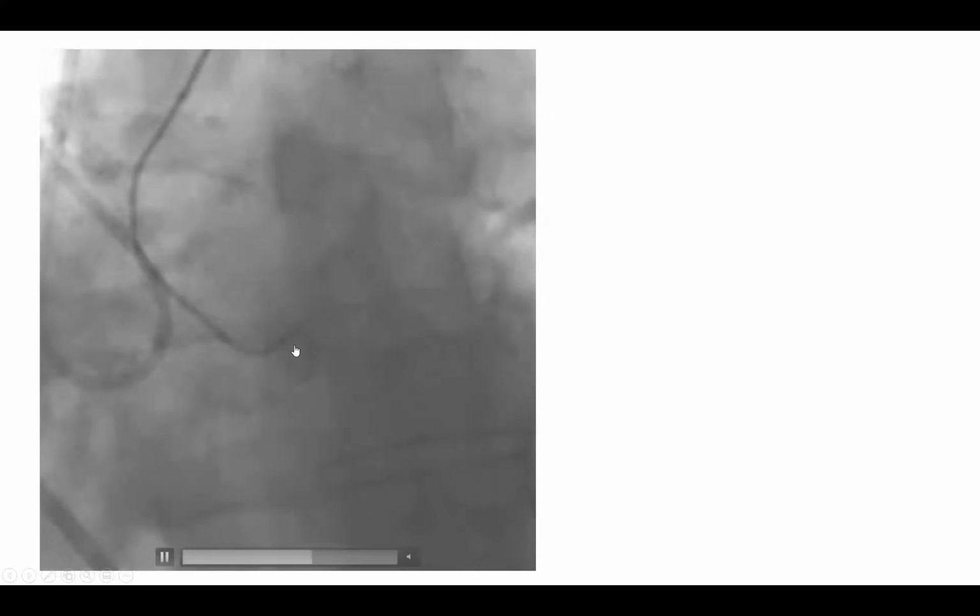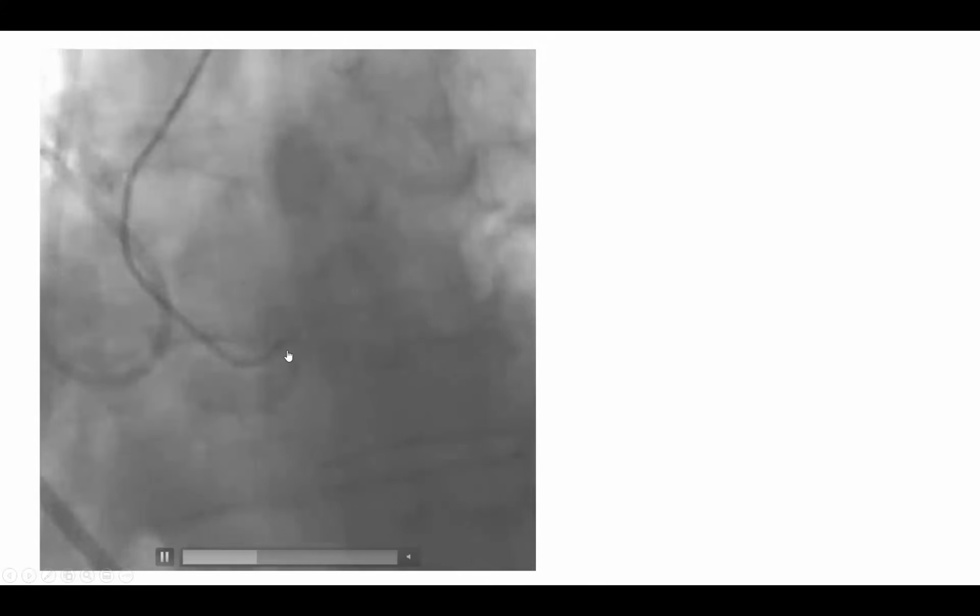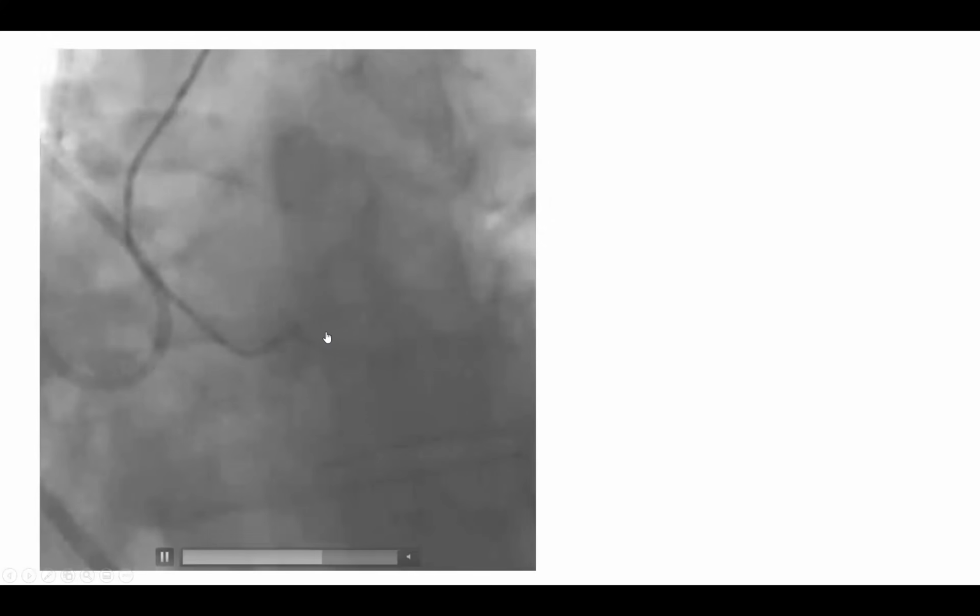So even though the operator may think, oh, I already jumped in the left cusp, if you give a puff and you see this ridge here, and you almost see a delineation of a cusp, a ridge with this cusp, this is the right sinus of Valsalva. You have not jumped yet. You need to jump before you pursue coronary engagement. You need to jump, then engage that left coronary.